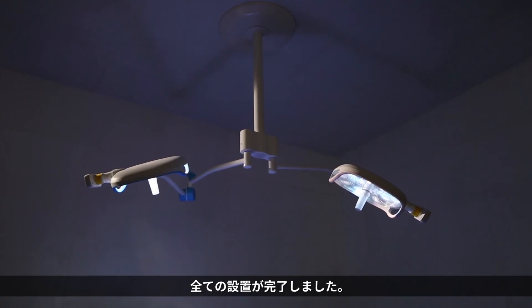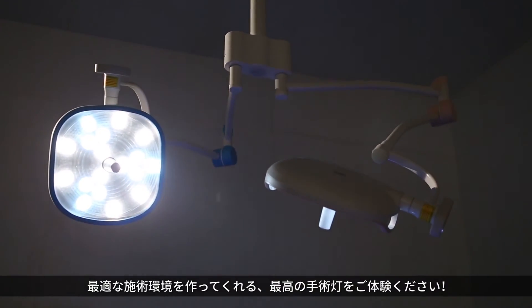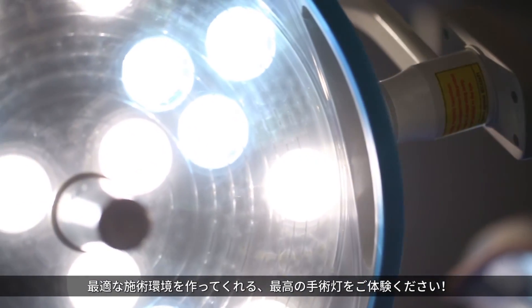Installation is completed. Experience the best operation lamp that will create the optimal operating environment for you.